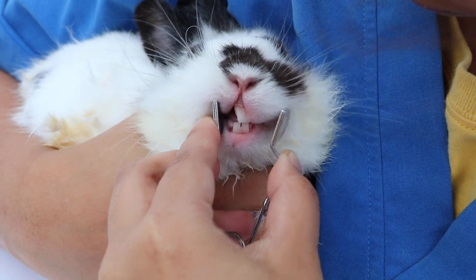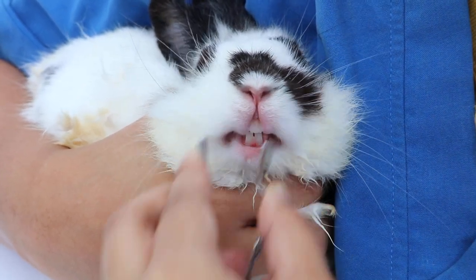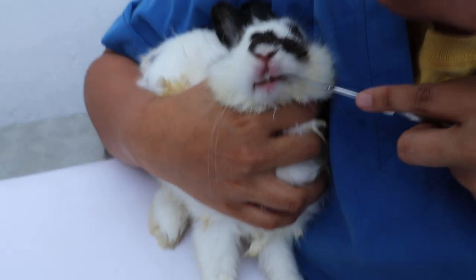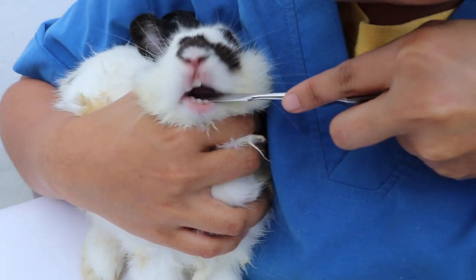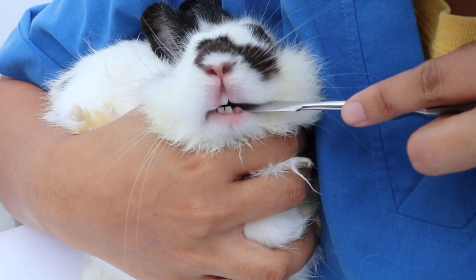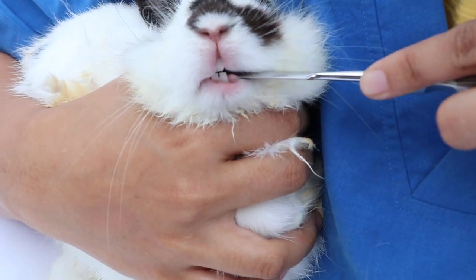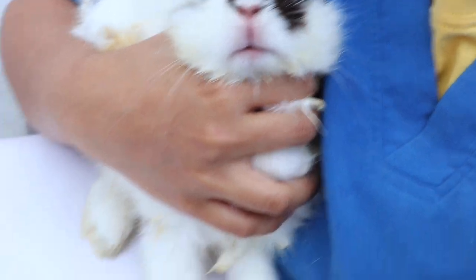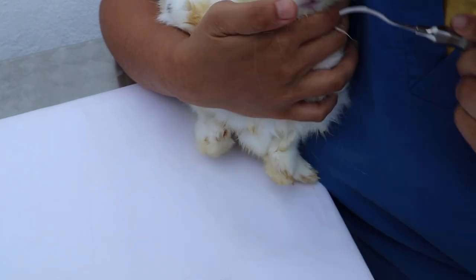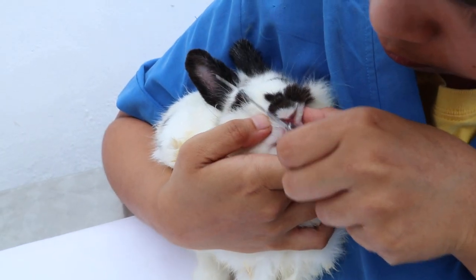That is the purpose of the cheek dilator. The next one is the tongue spatula, used to depress the tongue so that you can see the upper and lower cheek teeth properly — of course, under sedation.